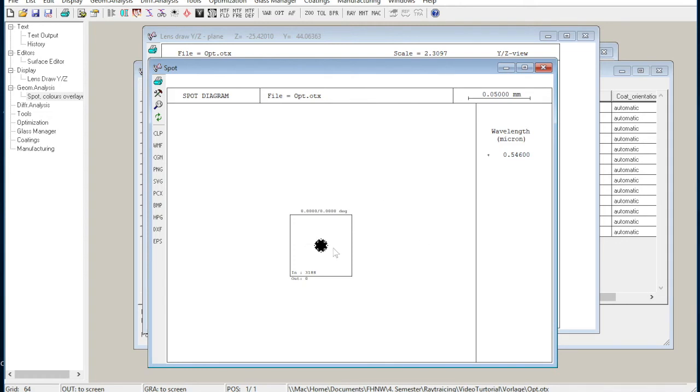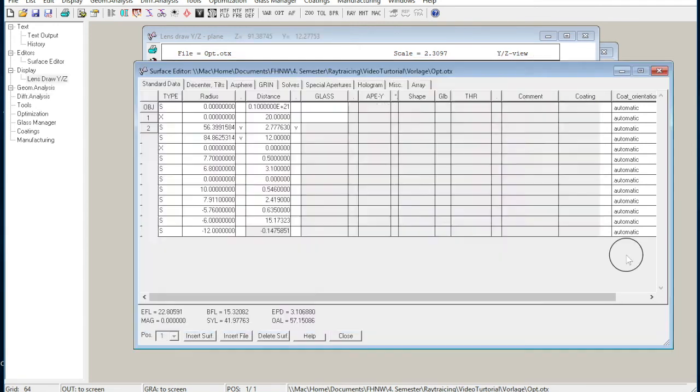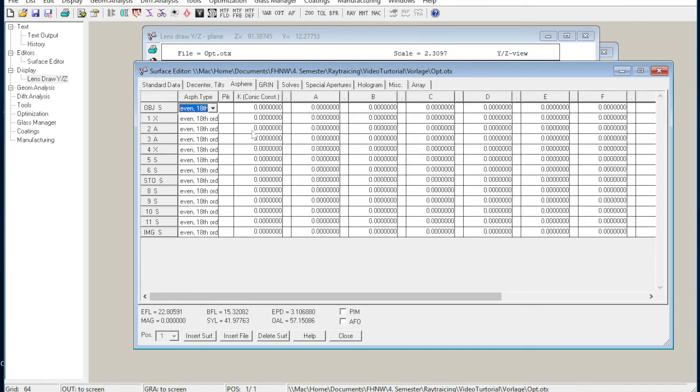But can we go further and optimize the system even more? Let's try it by making the surfaces aspheric. We'll show you how to do it. First, we have to change the surfaces here from S like spheric to A like aspheric. Click on Asphere and type a random number here in the column K. Like here, -3 and 2 in this line.